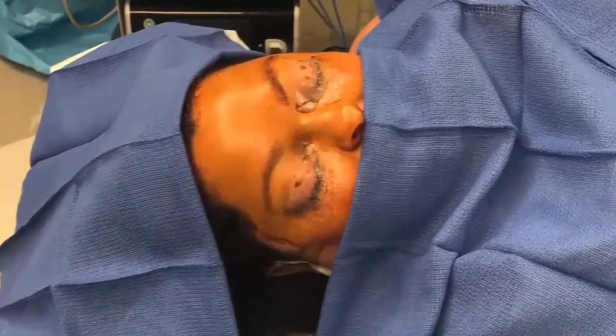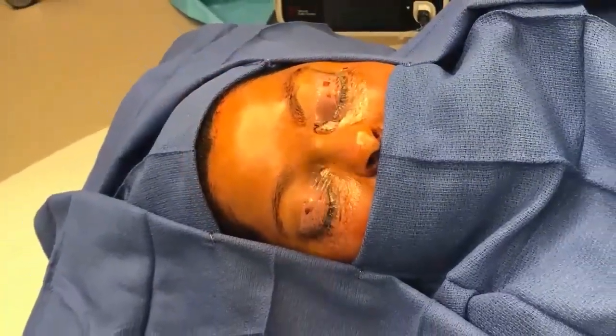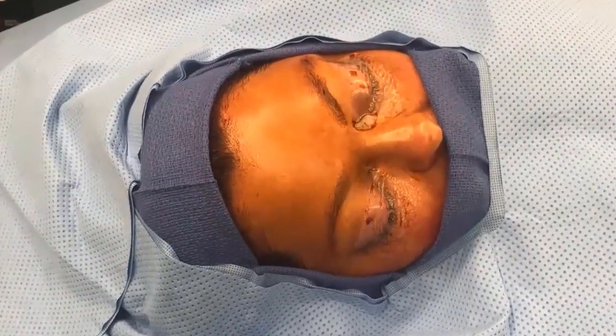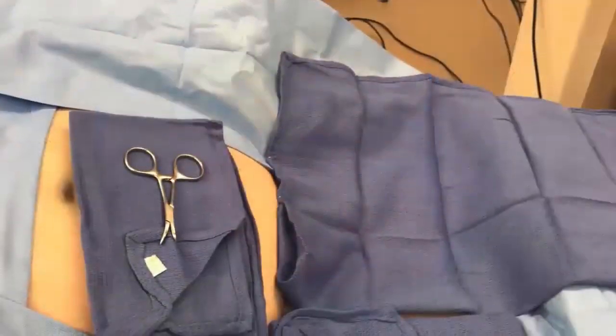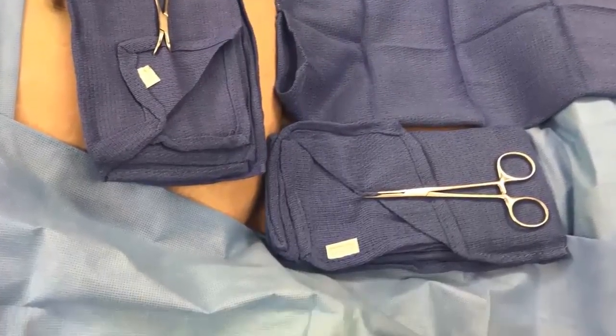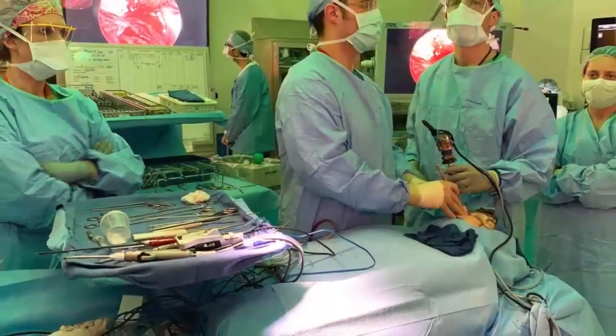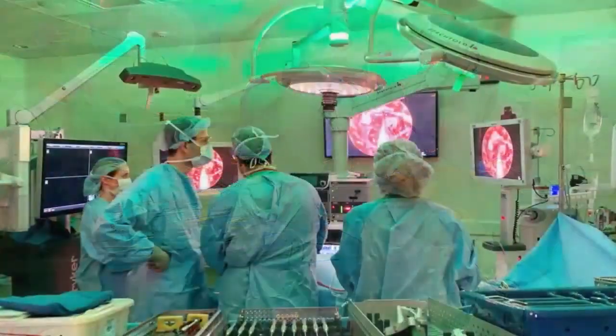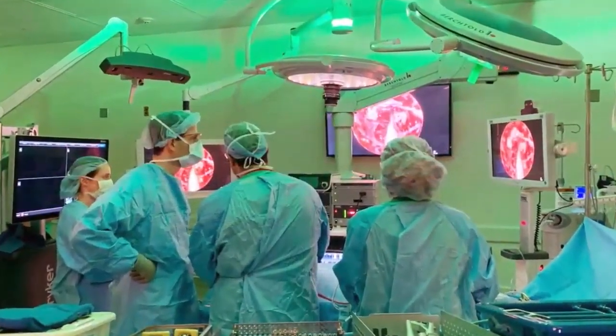To approach this lesion, we utilized a transsphenoidal endoscopic endonasal assisted approach. The patient is positioned supine, as seen here, and the head is turned and the nostrils are presented towards the primary surgeon. The abdomen and right leg are prepped for either a fat or fascial autograft if needed. The patient is positioned 180 degrees away from anesthesia, so the primary surgeon and the ENT surgeon have direct visualization to their monitors.